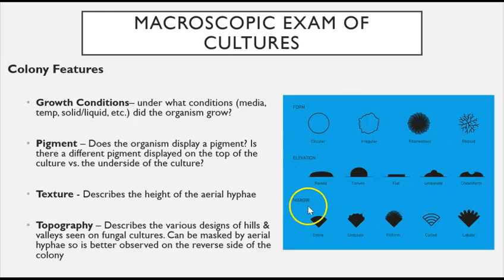This is a really good diagram showing some of the colony features that you could see in a fungal colony. Here are those elevations, that topography, those hills, valleys, dips that you may see in a fungal culture. The margins: what does the edge of the colony look like?